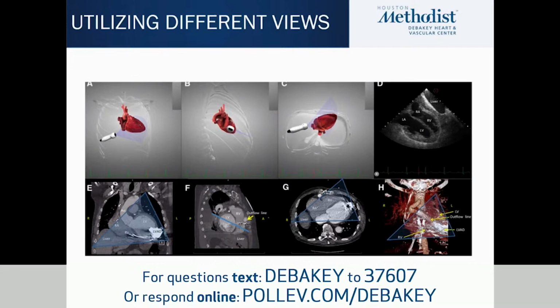So definitely there is room for more research and understanding other ways to image these patients where it's hard to image by regular views.